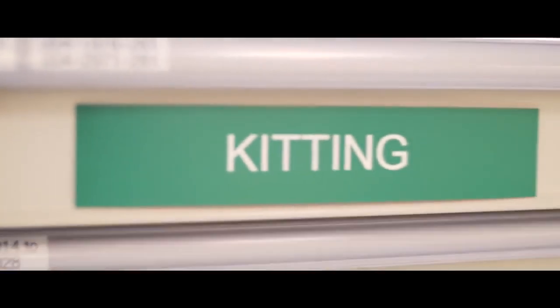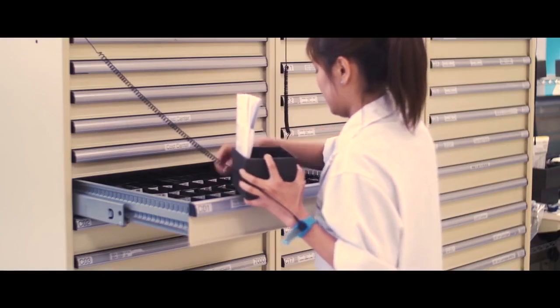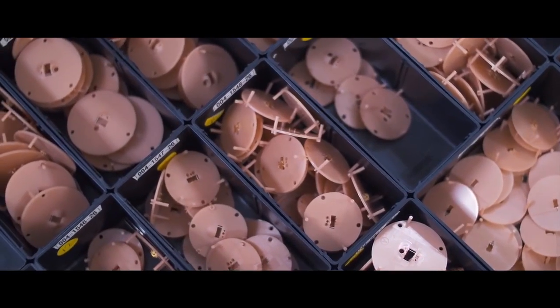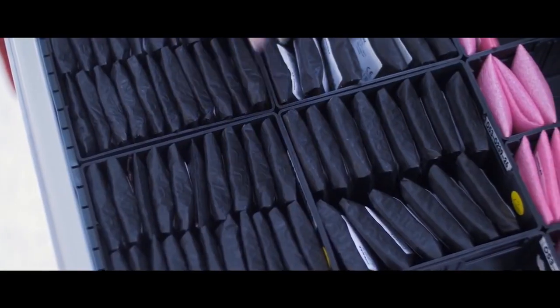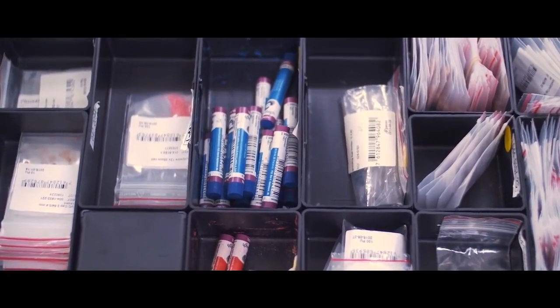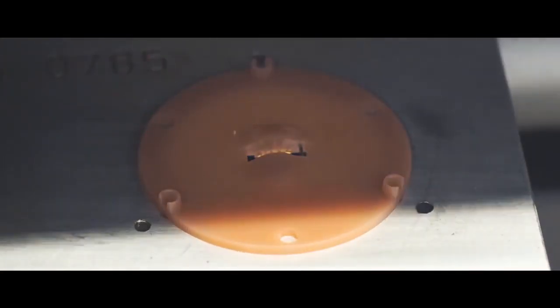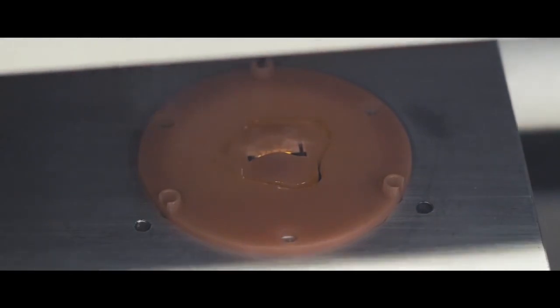The orders will then go to kitting. Our kitting cabinets hold all the components our lines might need to build the shells. We have over 400 different faceplates. We also have our receivers. We have mic screens, push buttons, VC wheels, wires. We have everything. Once they pick the correct faceplates, it will go into another Versa laser, and the laser will then cut an outline of the faceplate, again as to what RSM had modeled.